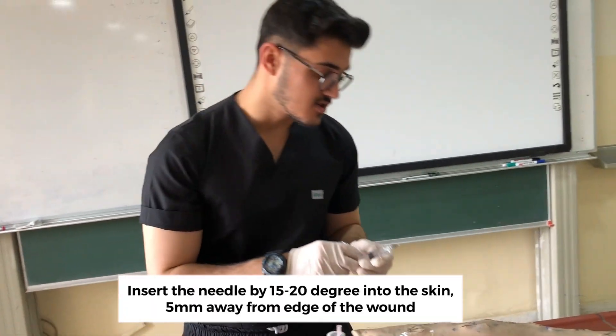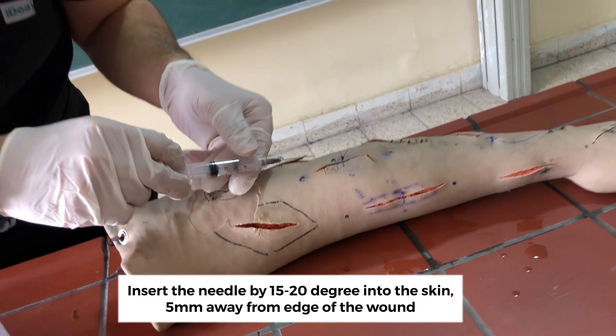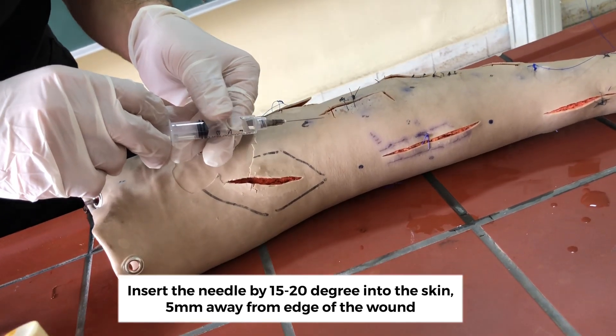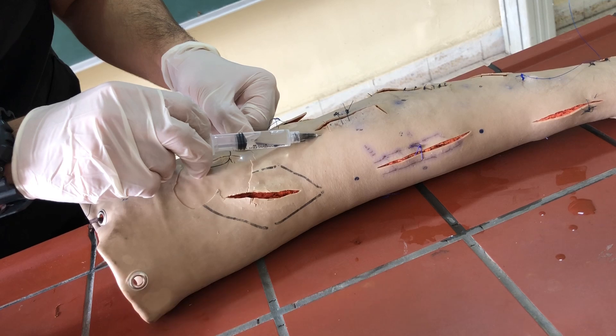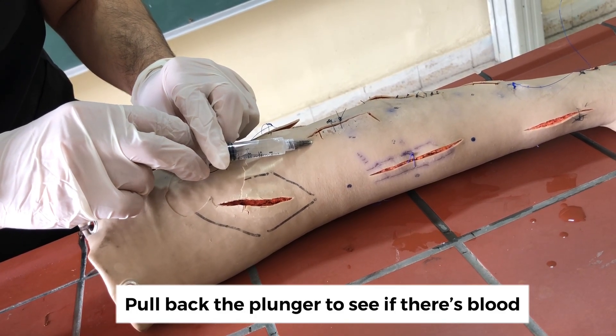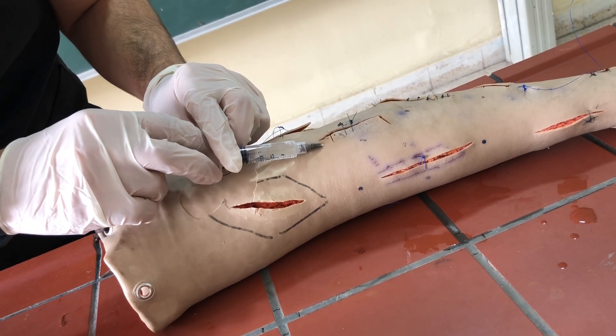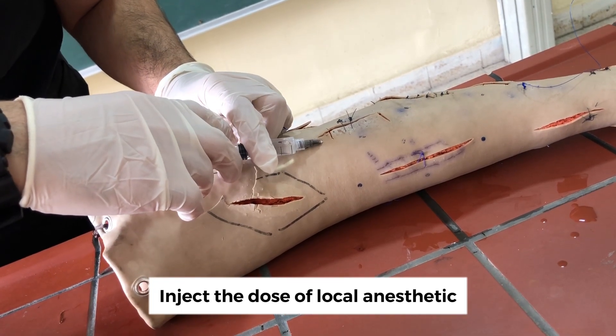We insert the needle at 15 to 20 degrees and 5 millimeters away from the edge of the wound. We pull back the plunger to check for blood. If there is blood, we change the area. If there is no blood, we slowly inject the dose of the anesthetic.